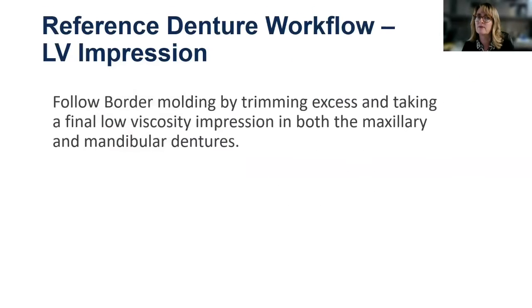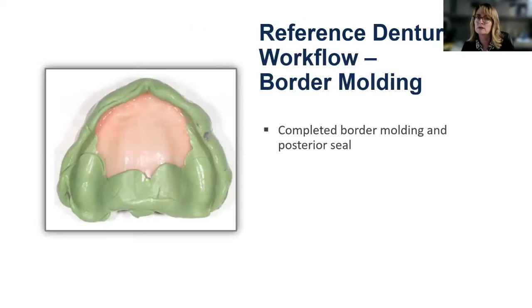And we're going to clean it before the border molding and wash impression. So this is an example of what that border molding looks like. Want to make sure that we are covering that posterior seal.